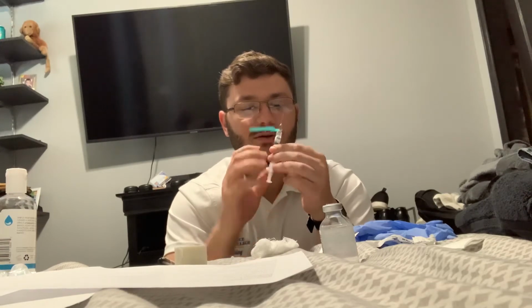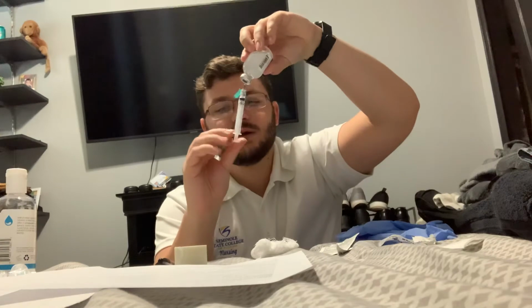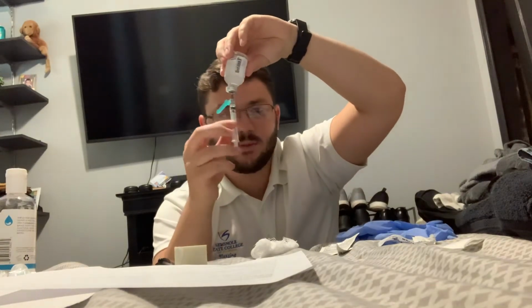Okay. I'm going to draw 0.5 mLs of air because that is what I'm gonna be putting into the syringe. Okay. So like a dart, I'm going to insert, and I'm going to ensure that the needle does not go into the medication. I'm going to insert 0.5 mLs of air. Okay, flip it over, and I do not want to touch the inside portion of the plunger.